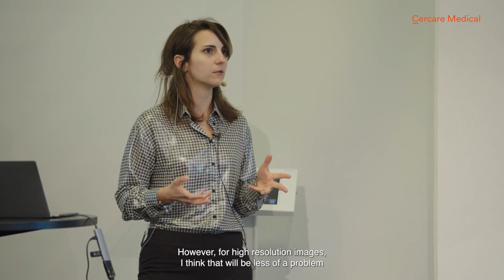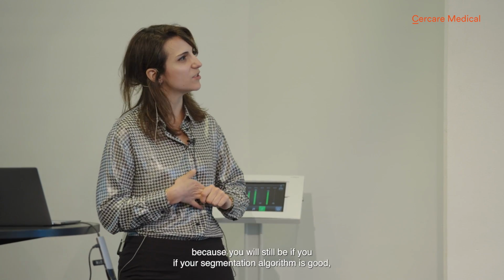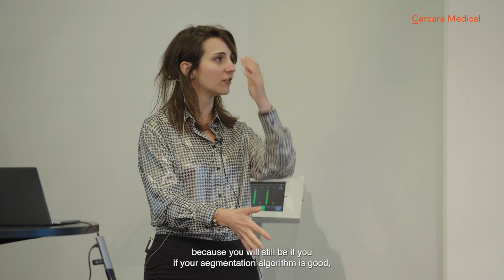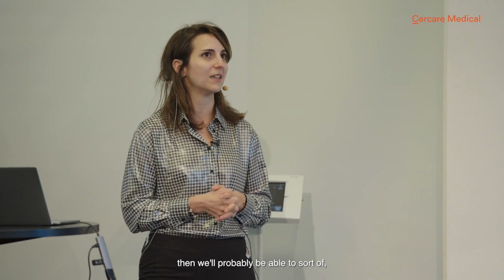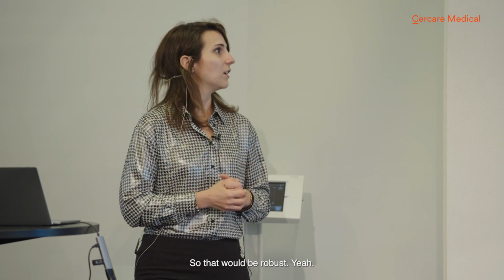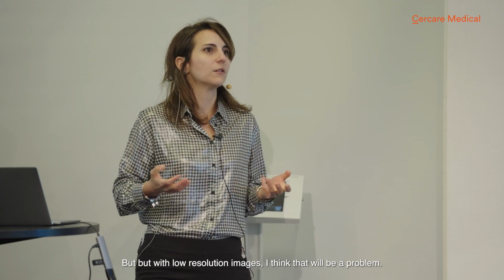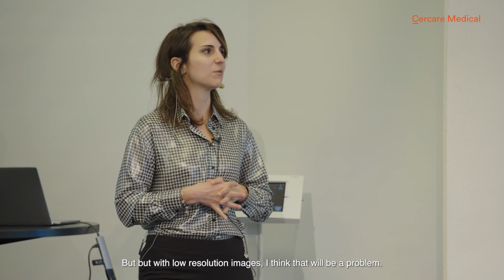However, for high-resolution images, I think that will be less of a problem, because if your segmentation algorithm is good, it will probably be able to make this accurate regardless. Yeah, so that could be robust. But with low-resolution images, I think that will be a problem.